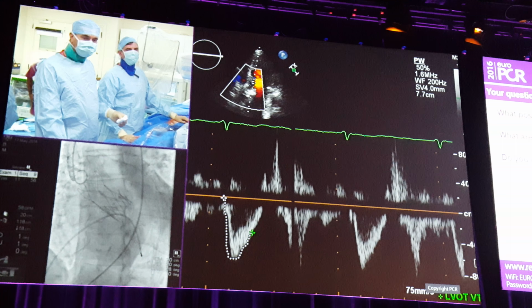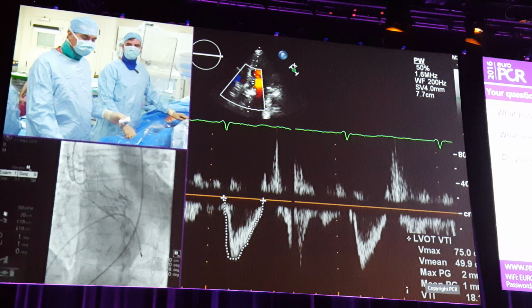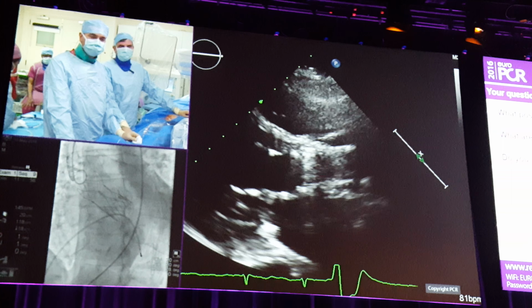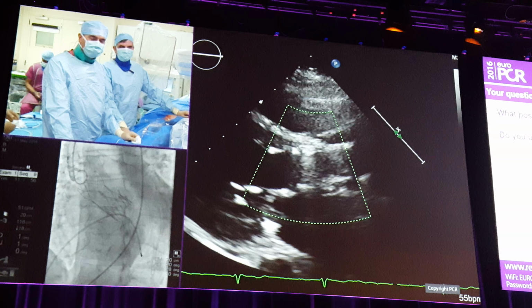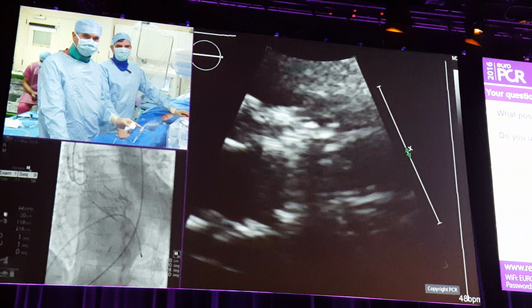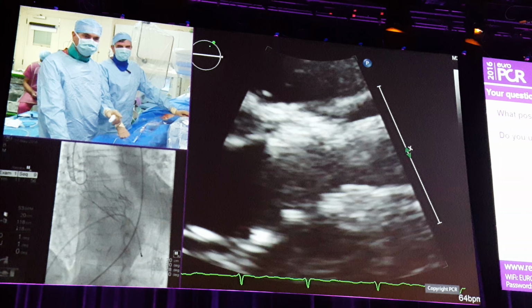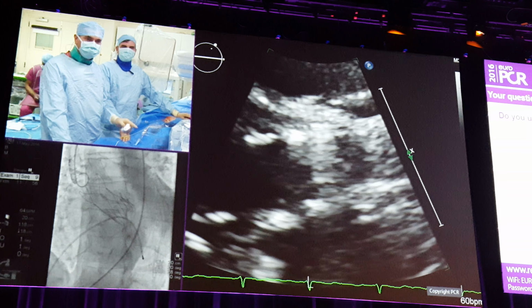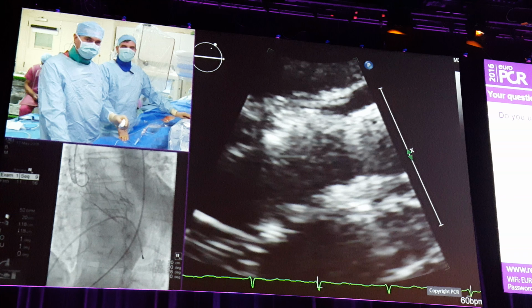Actually, one question from the audience was, in case you need post-dilatation, actually this is not quite a fair question, because here you don't need any post-dilatation. What kind of balloon would you typically use, if required? Well, for this case, we would use the same balloon that we pre-dilated with. What I failed to tell you was we pre-dilated with a 25mm balloon, but we removed a couple of mils, so it wasn't quite fully inflated. But we would post-dilate with a 25 with a full volume.